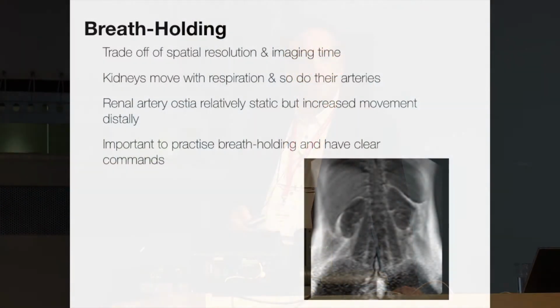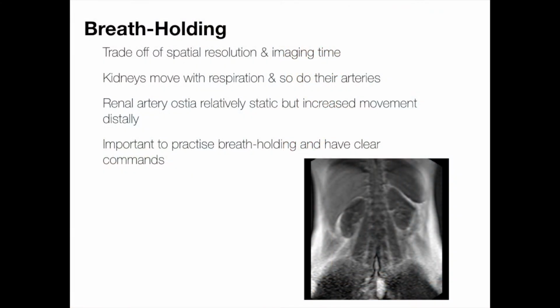So it's really important to practice the breath holding and have clear commands to the patient. And the clear commands have to be heard by the patient, which is why I moved in my protocols to using a timing bolus and not using fluoro triggering. Because if the gradients are humming and banging while the contrast is going in, the patient may not hear the clear breath hold commands. If you do a timing bolus, you know the gadolinium is going to arrive at 23 seconds or whatever it is, and you can have a nice quiet time in the magnet while you count down to that 23 seconds, and you get them to breathe in, breathe out, breathe in, breathe out, hold your breath at the right time.